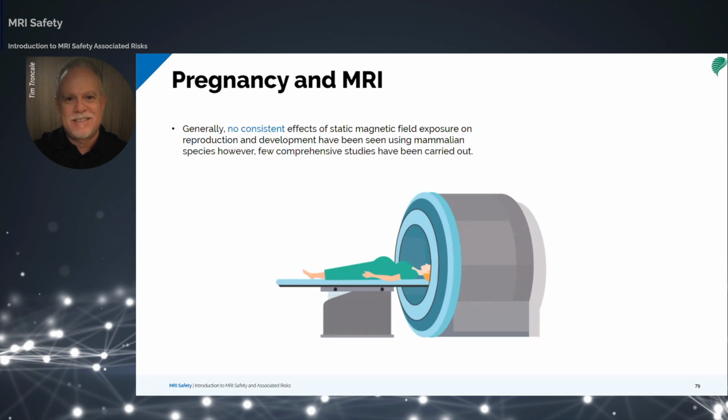With no definitive confirmation of the absence of risk, researchers do not want to expose the unborn child to MRI for research purposes. Therefore, data is mostly collected by survey or follow-up of women who have had an MRI while pregnant. But this is not a controlled research study, and there is not much peer-reviewed literature.